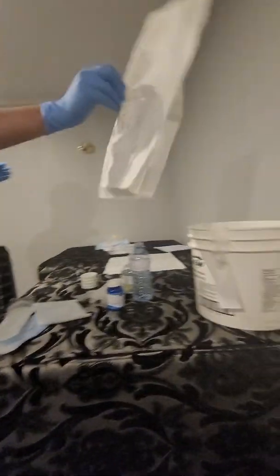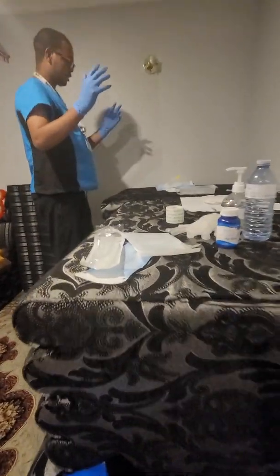Put in the garbage, and then now I'm sterile.